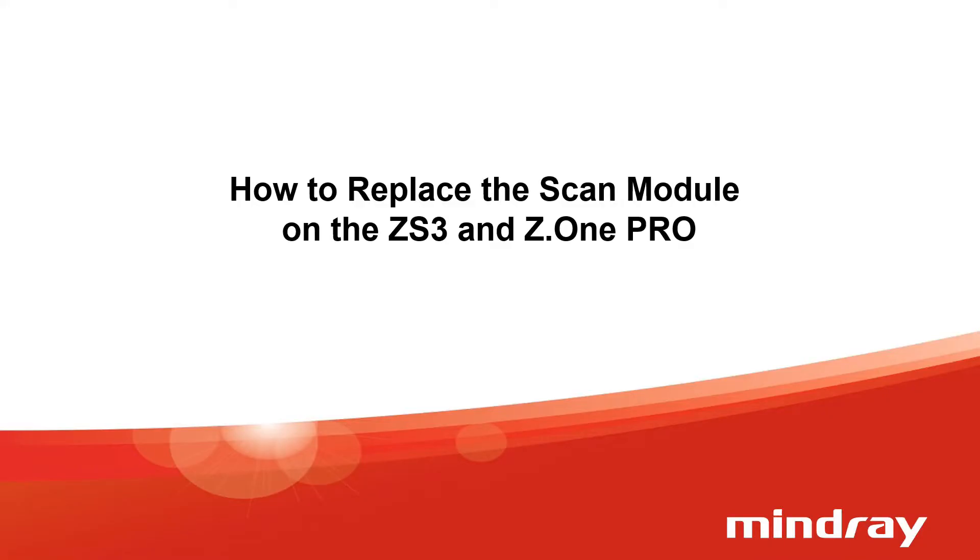In this video, we will observe how to replace the scan module on the ZS3 and Z1 Pro systems.